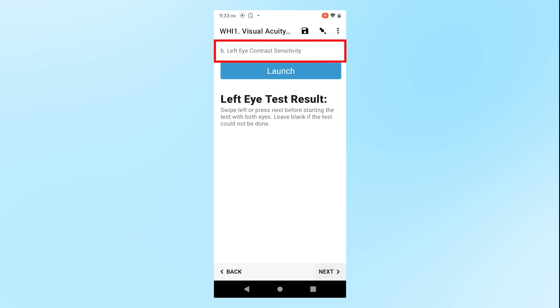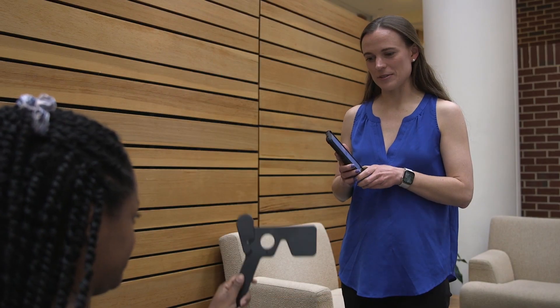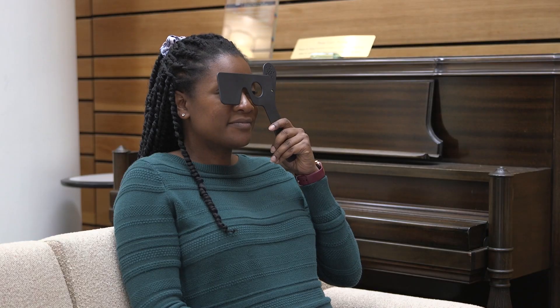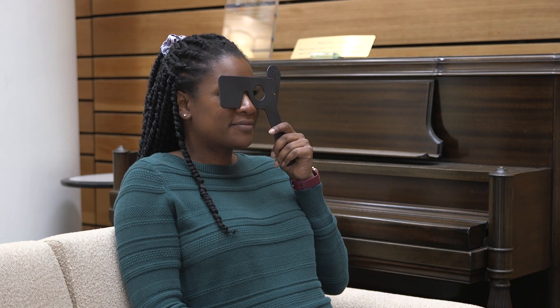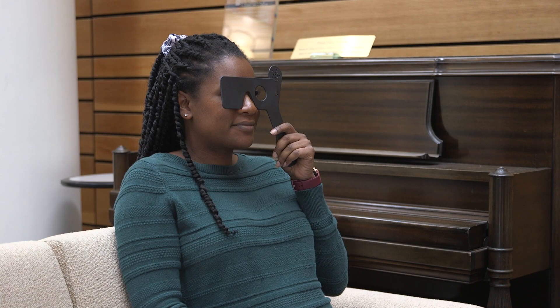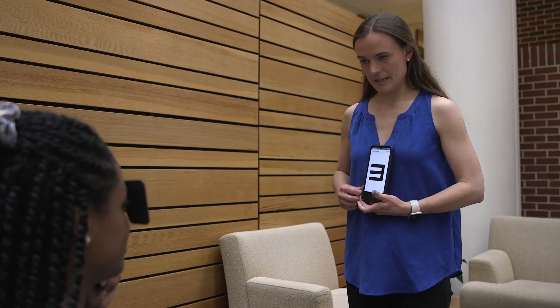Confirm that the page says Left Eye Contrast Sensitivity at the top and press Launch to begin the next screening. Instruct the participant to now cover their right eye with the occluder so they are only using their left eye to see through the large hole. Hold the phone at the participant's eye level and repeat the same steps to conduct the screening with the left eye.